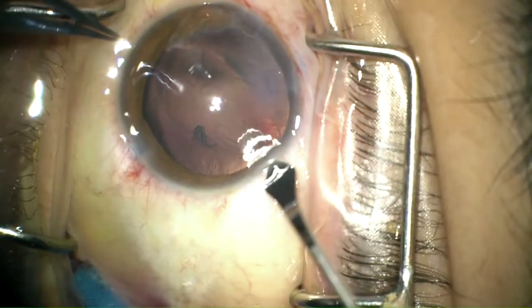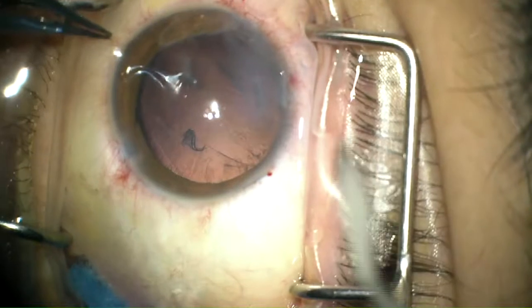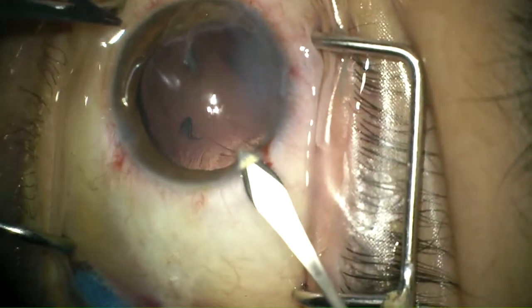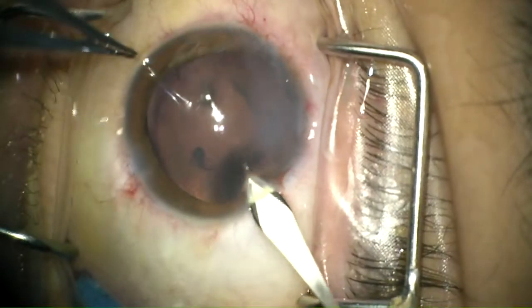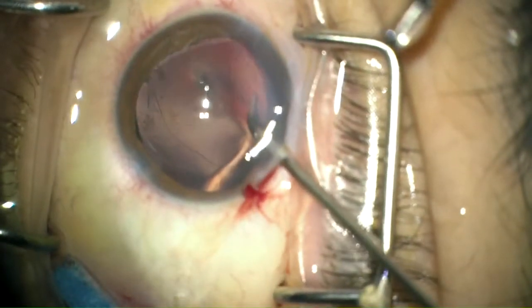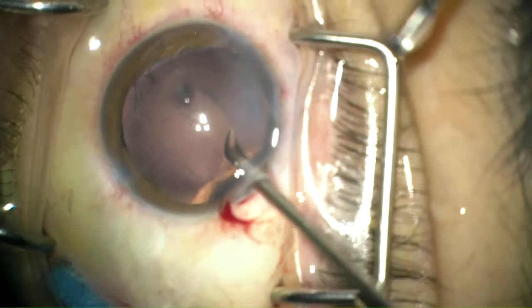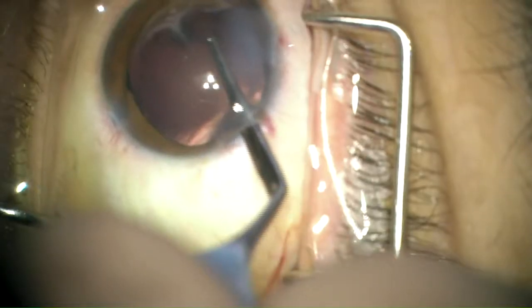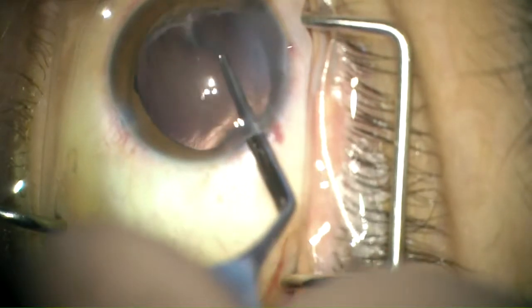The main wound was then performed in a typical manner of cataract surgery, followed by using a pair of intraocular scissors to snip the anterior edges of the capsular bag. This allows enlargement of the capsular opening to facilitate implantation of the intraocular lens and to prevent any contraction of the anterior capsule postoperatively.